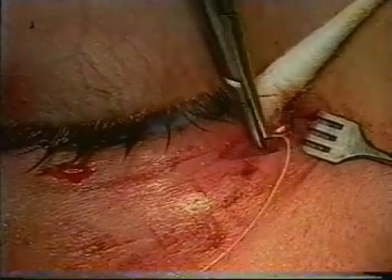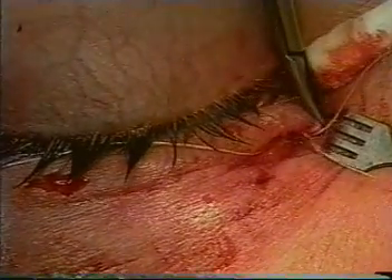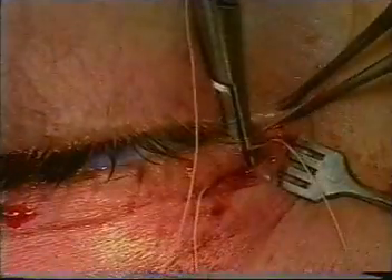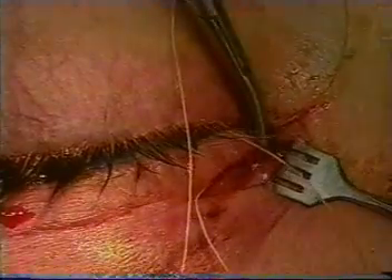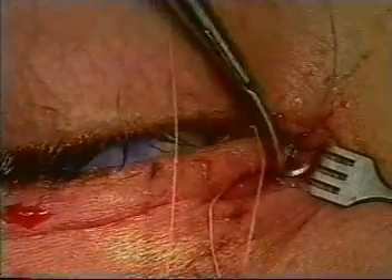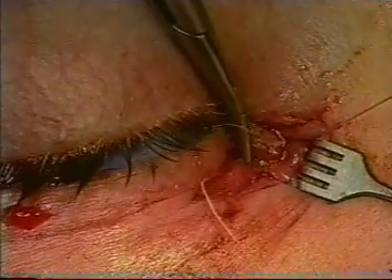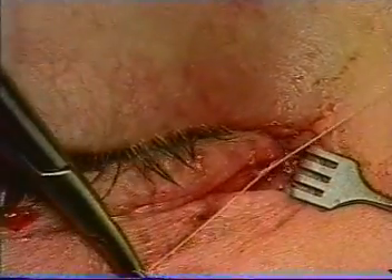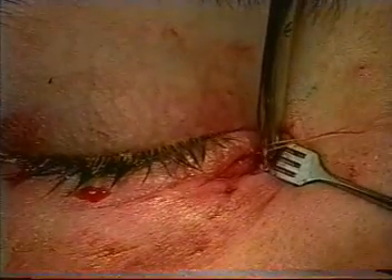Here we see the second suture being placed. At the end of the procedure, the lid should be in excellent anatomic position, with the punctum in its normal position within the lacrimal lake. It is unusual to need more than two sutures to hold the lid in place.